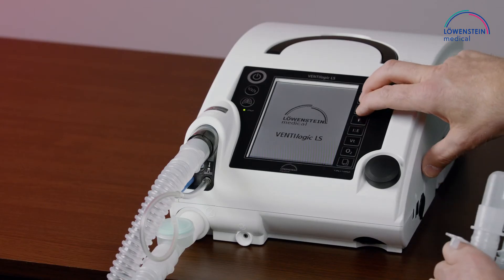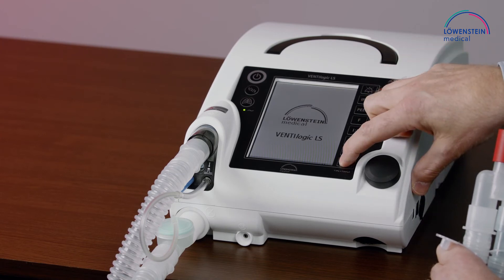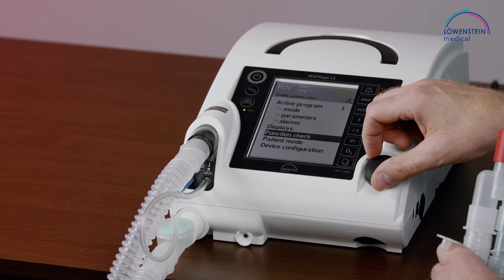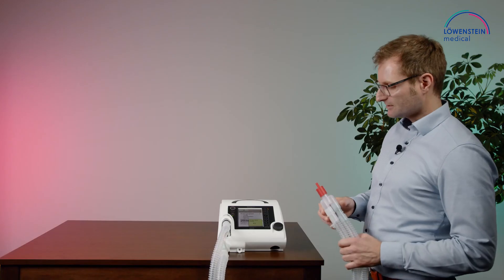Then I go into the menu by unlocking the device, pressing and beeping until this message is gone. Go into the menu, go to function check, select function check, and this will take about 15 seconds.